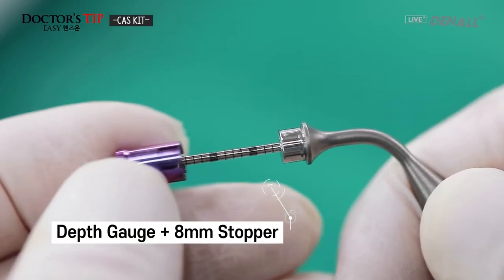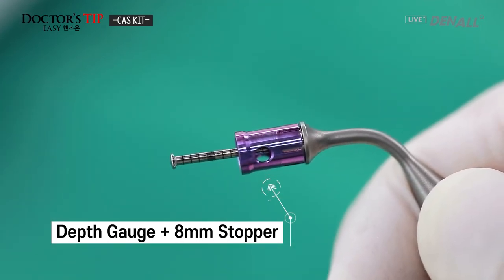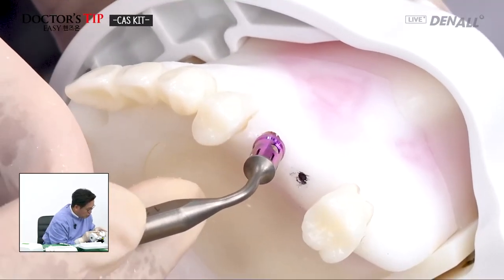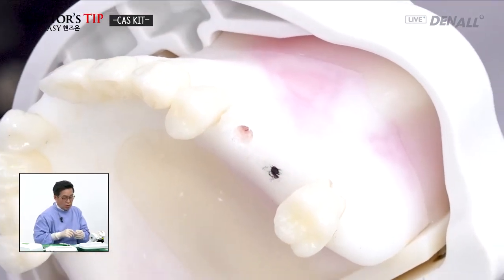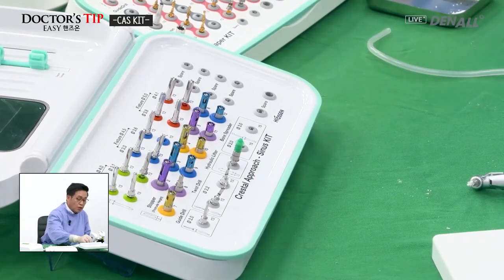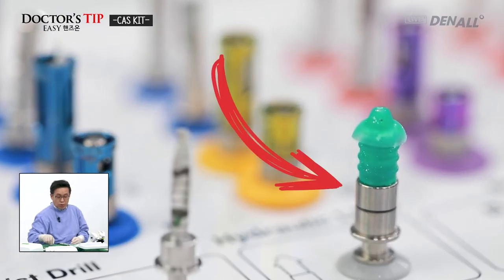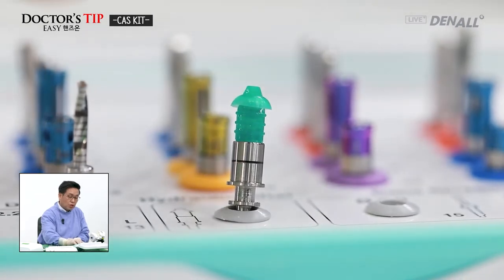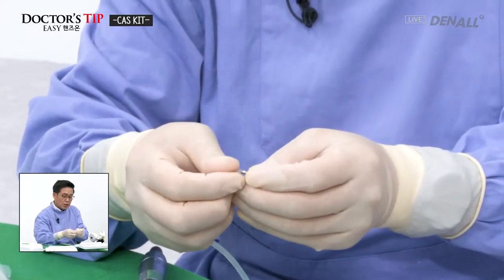Now it is drilled. Once again, the 8 millimeter stopper is connected to the depth gauge to check. As you can see, partial penetration is confirmed. Now hydraulic elevation will be done. Partial penetration is done on the slope and the hydraulic elevation is to be done. The hydraulic lifter is removed and connected to the silicon tube.